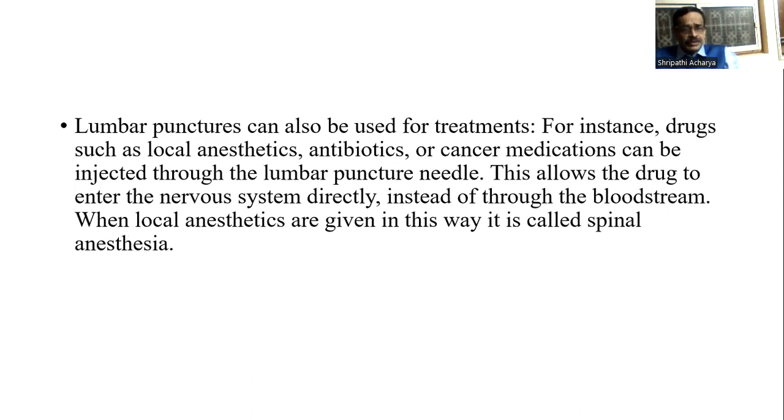Lumbar puncture can also be used for treatment. For instance, local anesthetic, antibiotics, or cancer medications can be injected through the lumbar puncture needle. This allows the drug to enter the nervous system directly instead of through the bloodstream. When local anesthetics are given this way, it is called spinal anesthesia.